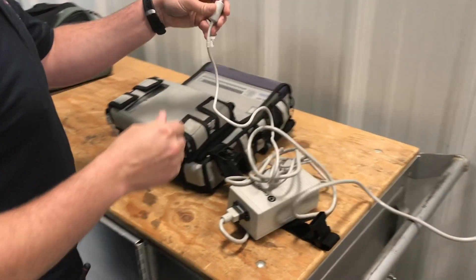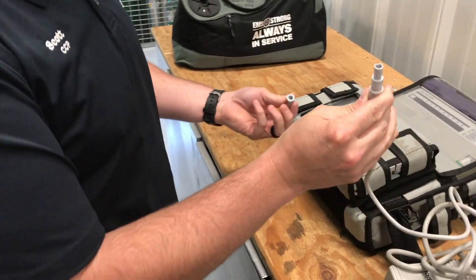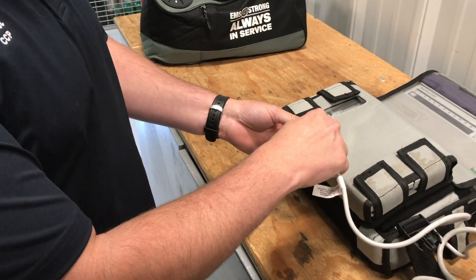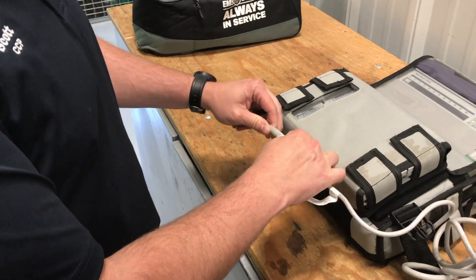Plug it in. The opposite end you'll notice has a radius with a square on top. Like most medical devices it'll only go together one way. Take the two pieces and simply click them together — you'll hear it click and it won't come apart.